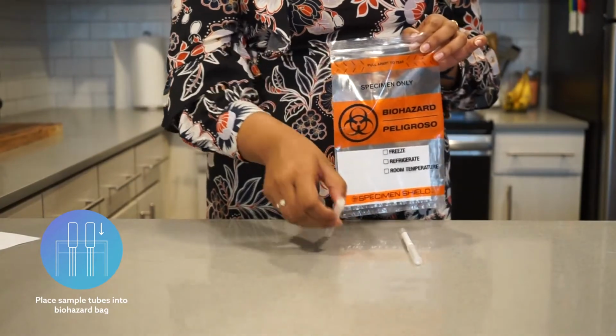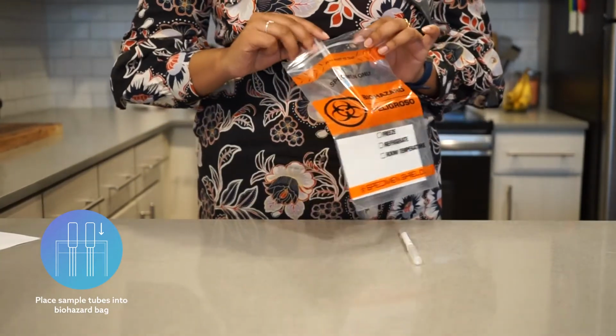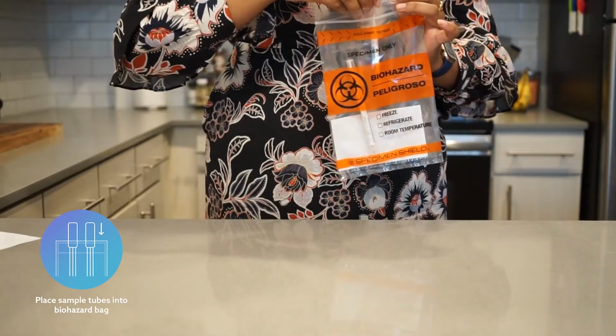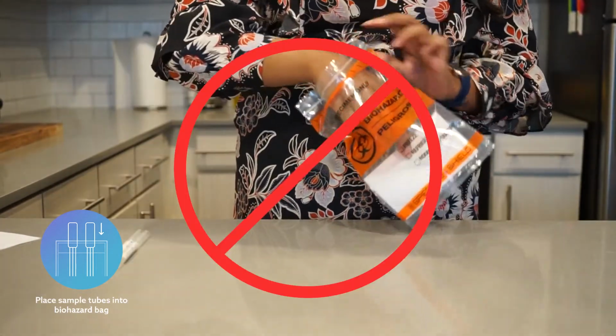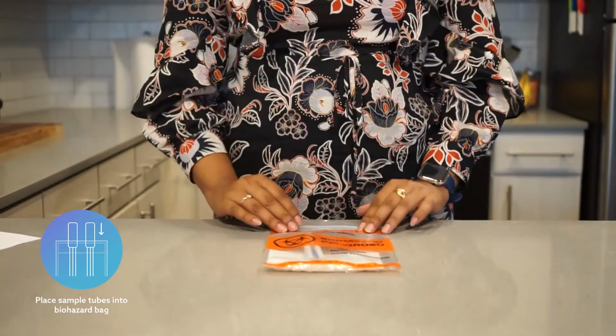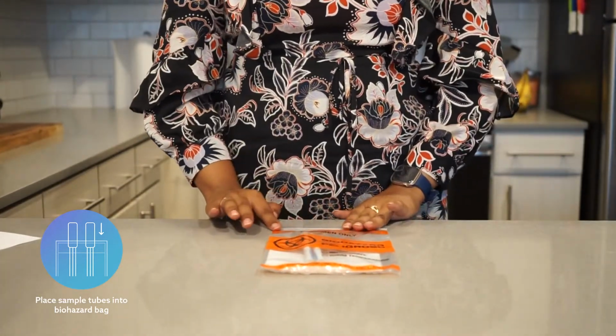Take both sample tubes containing your cheek swabs and place them both into the biohazard bag in the same section as the absorbent pad. Do not remove the absorbent pad. Then securely seal the biohazard bag.